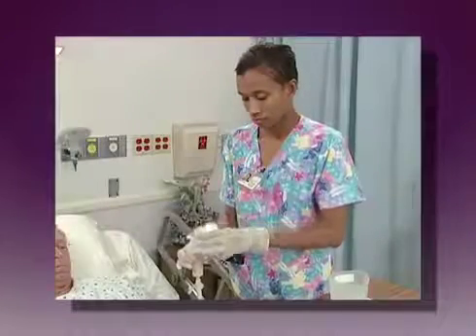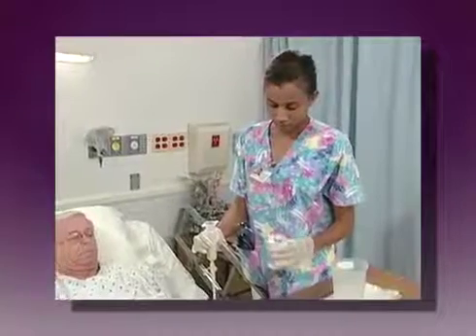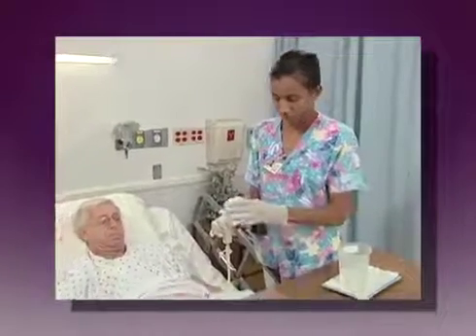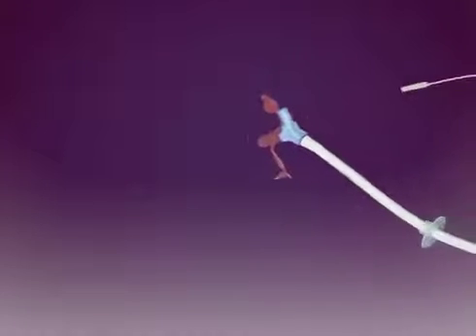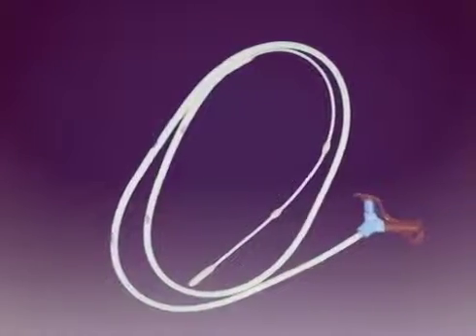Most feeding tubes are now made of silicone or polyurethane, materials which are both durable and biocompatible, and they have a variety of design and feature options that have increased the complexity of their care and maintenance. As a start, this program will identify the various feeding tubes and their components.